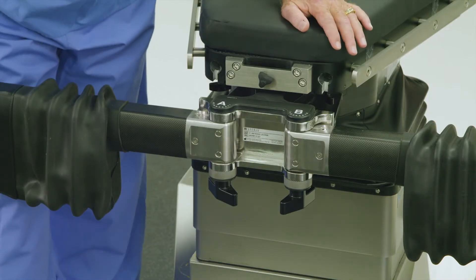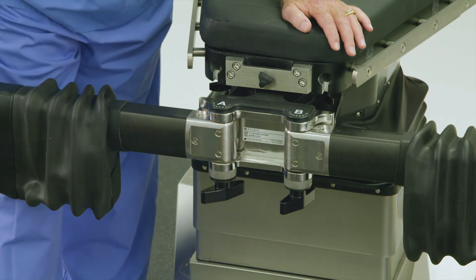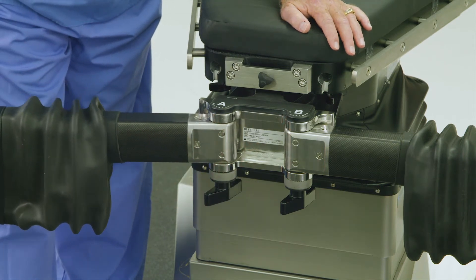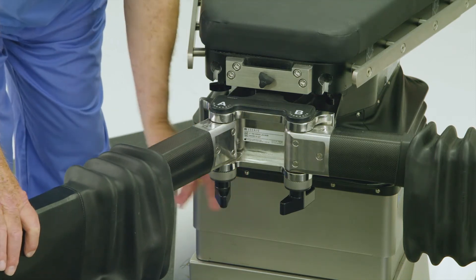To position the abductor spars for hip pinning in bilateral traction for an operative left leg procedure, loosen the knob below the A rosette and set the A joint to position 5, then re-lock the A rosette handle.